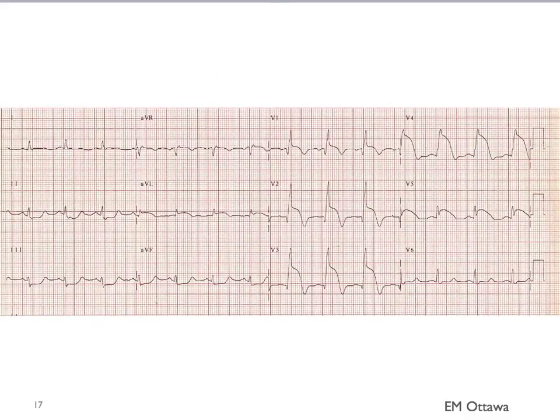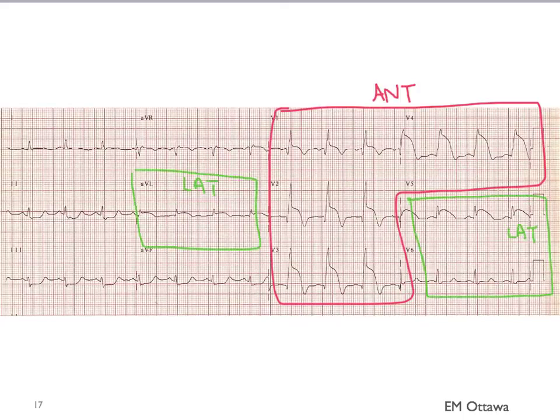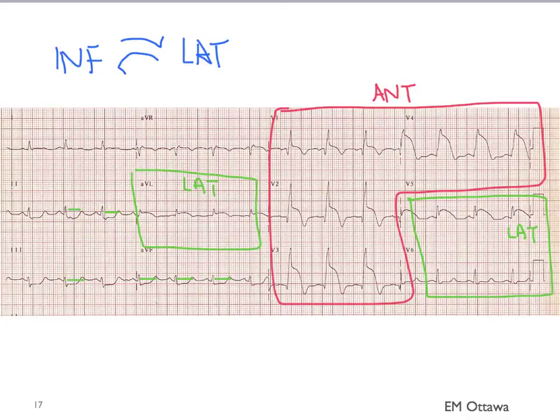What about this ECG? There are ST elevations in the anterior and lateral leads. Do you see any ST depression? You can see ST depressions in leads 2, 3, and AVF, corresponding to the inferior part of the heart. That makes sense because the inferior part reciprocates with the lateral ST changes. In a standard 12-lead ECG we don't do posterior leads, but with a 15-lead we would see ST depression in the posterior leads.